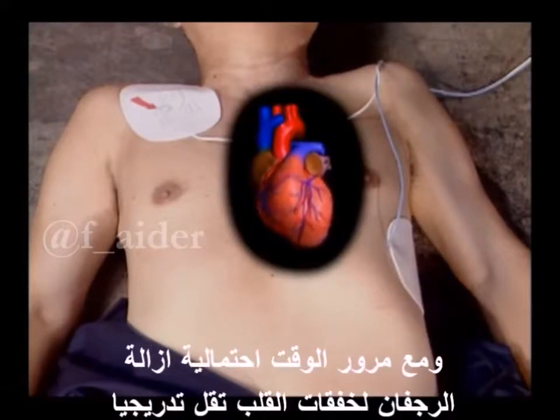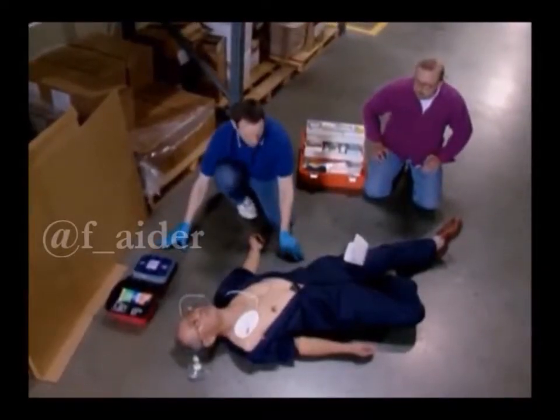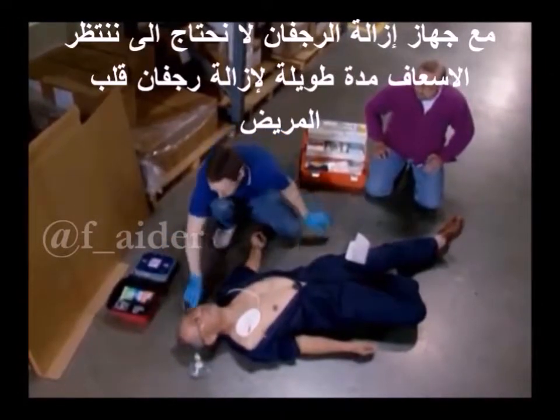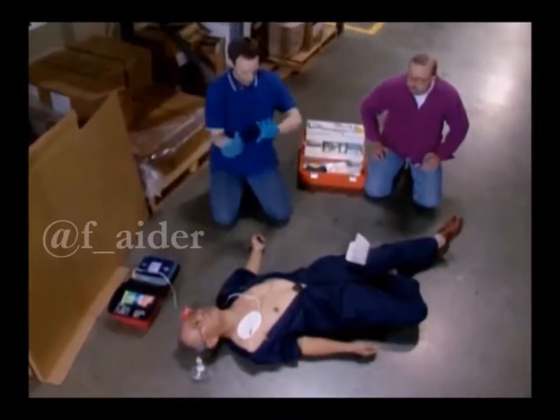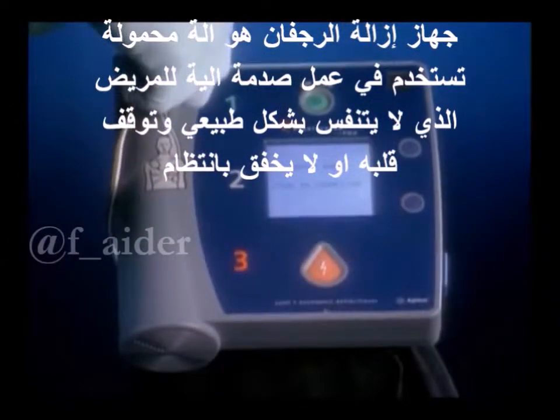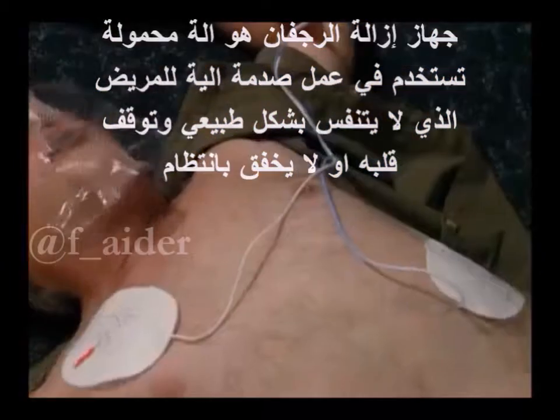As time passes, the probability of defibrillation restoring the heartbeat goes down. Automated external defibrillators, or AEDs. With AEDs, you no longer have to wait for emergency medical services personnel to defibrillate a patient's heart. An AED is a portable machine that automatically delivers a shock to a patient who is not breathing normally and whose heart has stopped beating or is beating irregularly.